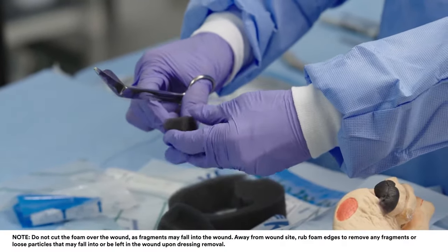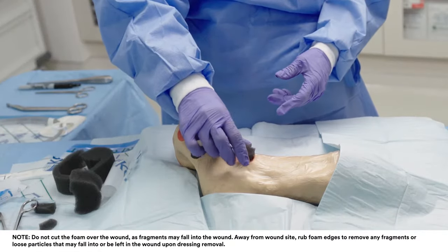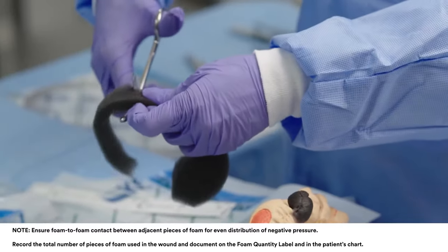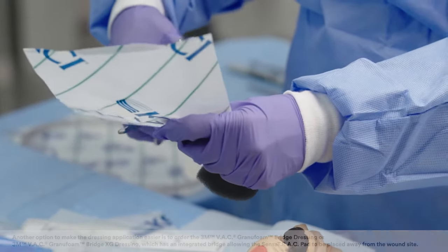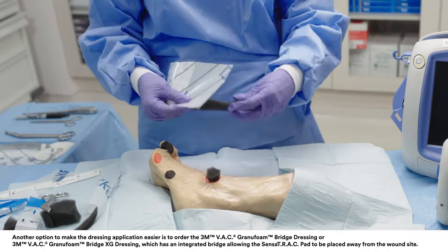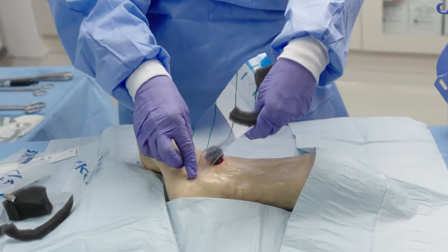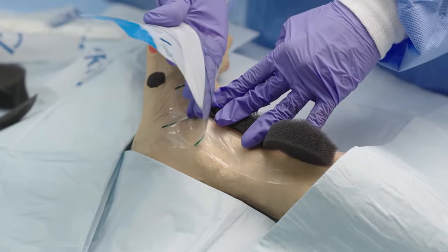Cut the foam dressing to dimensions that will allow the foam to be placed gently into the wound without overlapping onto the skin. Gently place appropriate VAC dressing foam into the wound cavity. Do not force dressing foam into any area of the wound. Cut one thin elongated strip of dressing foam. Place the piece of foam and ensure that it contacts the dressing foam in the wound. Ensure the foam does not come in contact with intact skin.